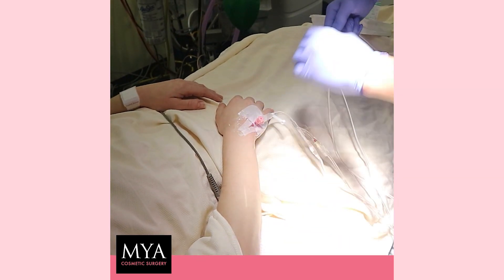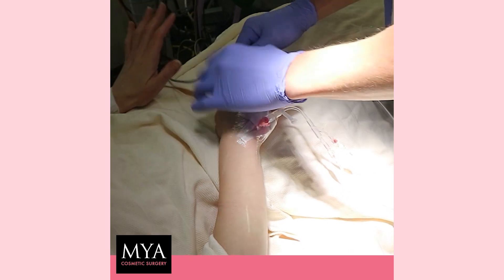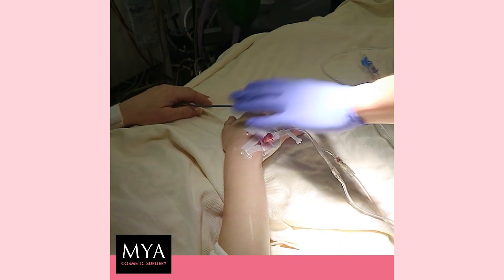It might feel a bit cold going up your arm. We're going to put this little bit of monitoring on the finger — this is just to measure oxygen.